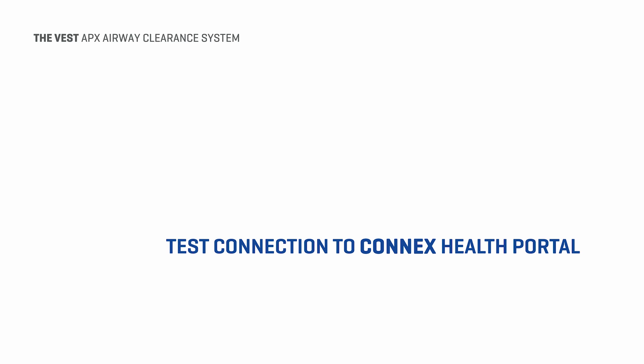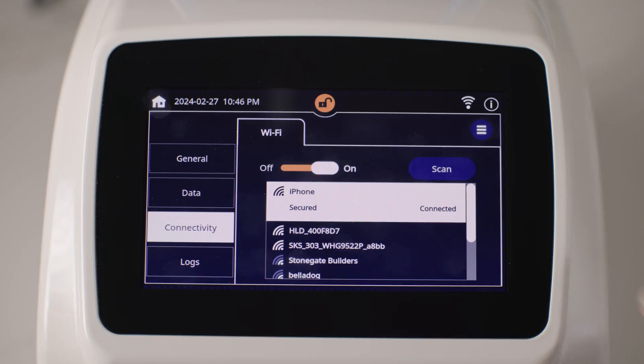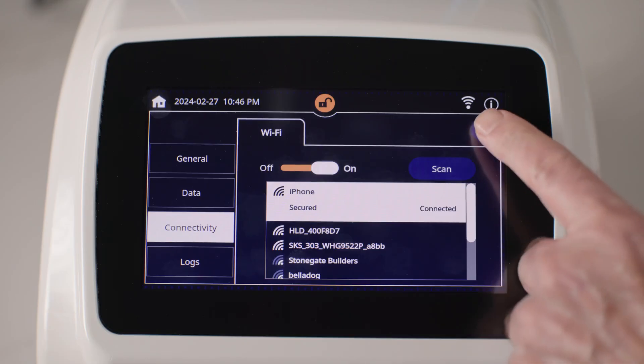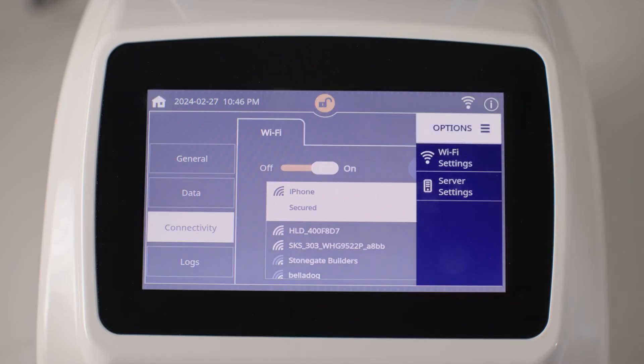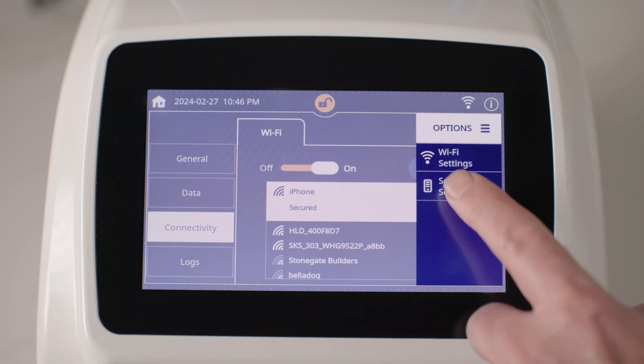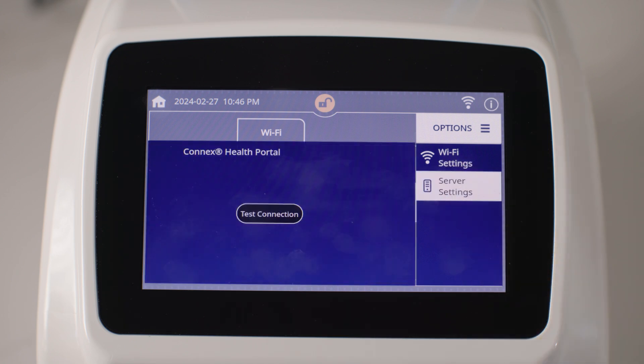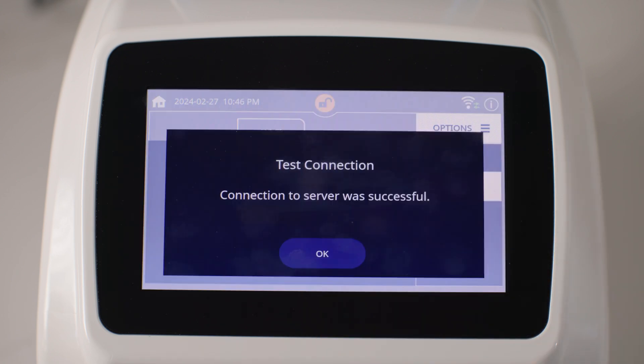To assure the most current data is synced to your device, follow these steps to make sure that the device is connecting successfully to the Connex Health Portal. Tap the options icon, then tap server settings, and finally test connection. If the connection is successful, a confirmation screen shows.